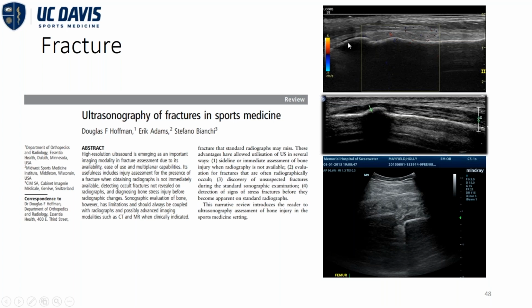We're using the ultrasound on long bones as well as short bones, but the key is they have to be flat bones. It's really hard to evaluate subtle changes in the smooth cortex of a bone if they don't have smooth cortices on their own. When you're looking at all the tarsal bones or the carpal bones, with a lot of unique anatomy, there are going to be a lot of little bumps and lumps on these cortices that are totally normal. So try to use ultrasound on bones in areas that you know ought to be smooth and flat.